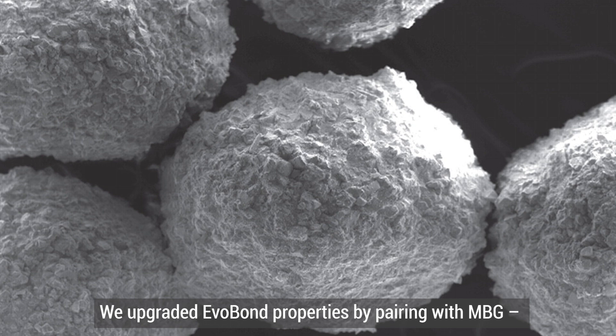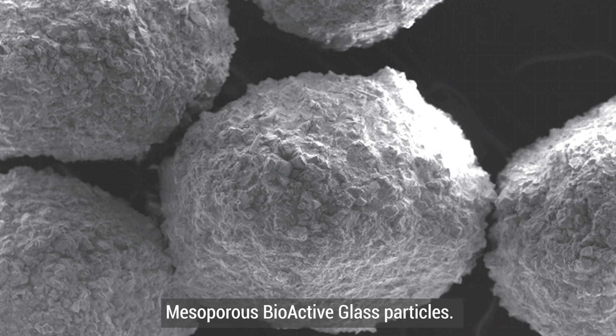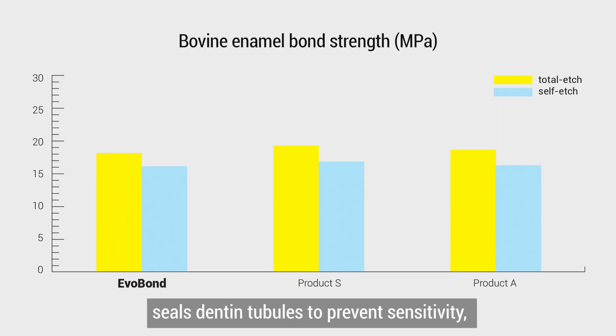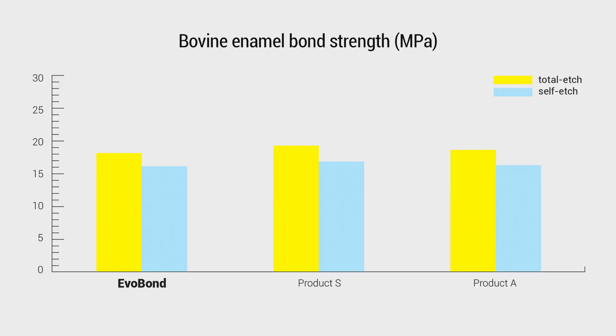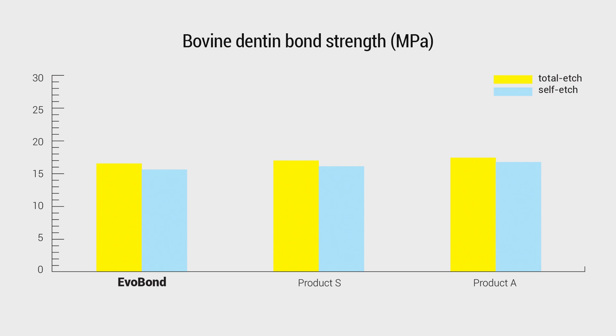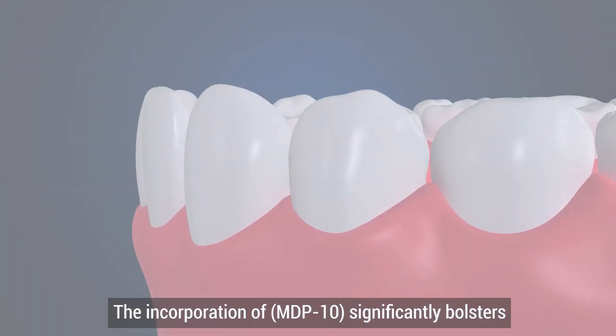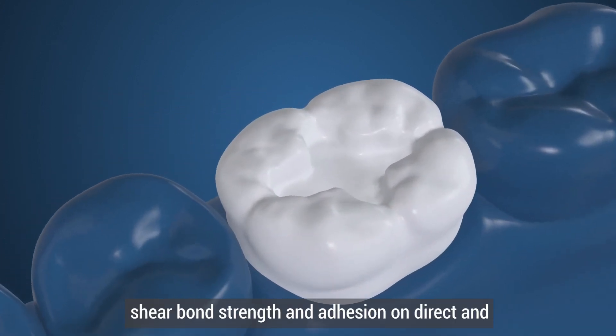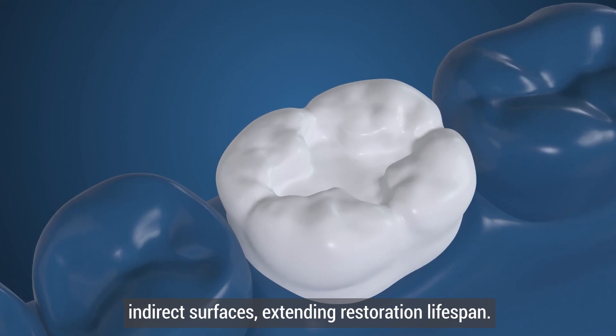We upgraded EvoBond's properties by pairing it with MBG mesoporous bioactive glass particles. This 3-in-1 liner, primer, and desensitizer promotes bonding, seals dentin tubules to prevent sensitivity, and reduces the risk of carious formation beneath the restoration.